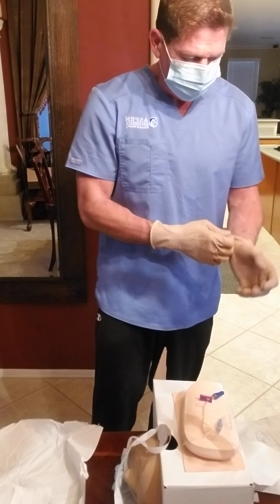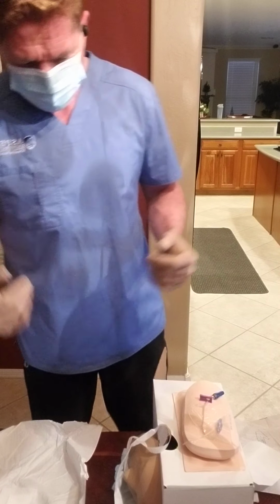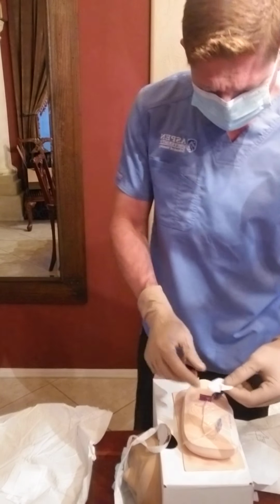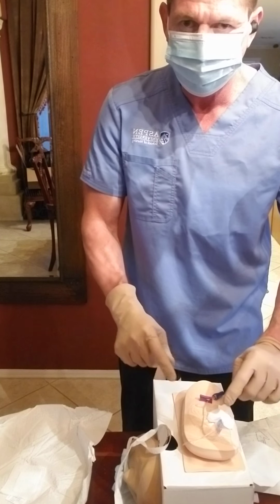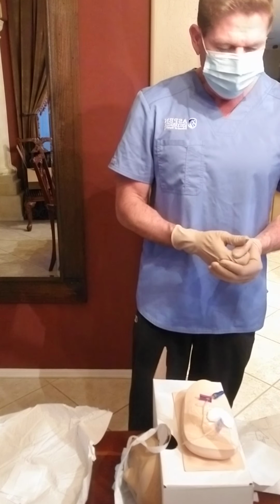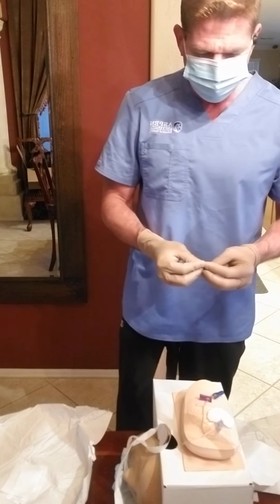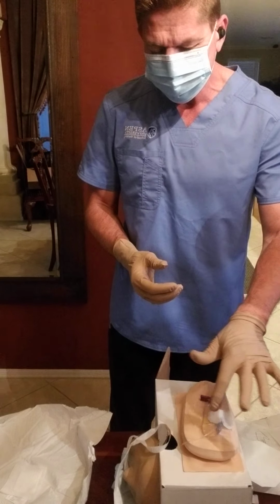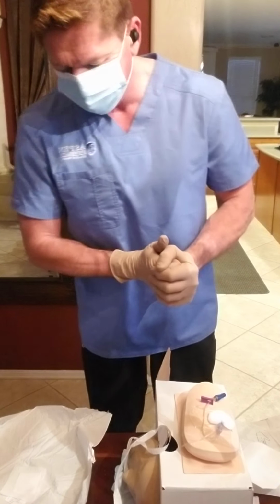So next, I am going to, crap, I totally forgot to use my round patch that goes around the incision here. I should have done that. And then I do the occlusive dressing over that. I don't have an extra occlusive dressing, but I did miss that step. Like I said, it's not in the package, so it was kind of hard to remember. Had I done this, I would go back, remove the dressing, put on the patch and the occlusive dressing, and start the procedure all over again and make sure I didn't forget that.